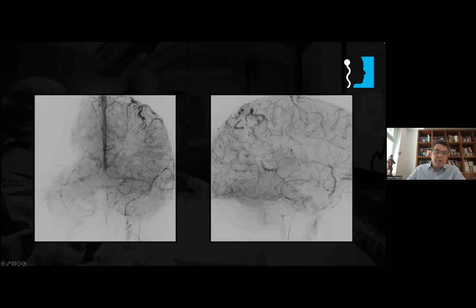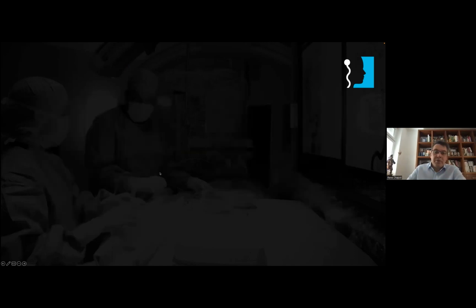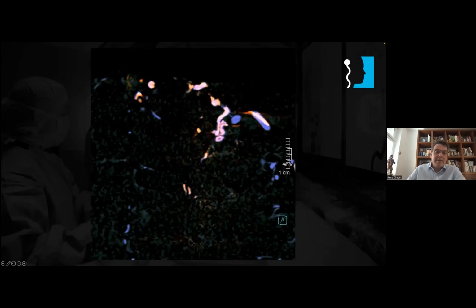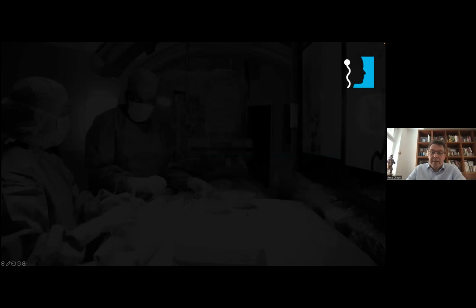But you see that the AVM is not cured, so there was a 3rd step to go to the vein I just showed, which is this one here. Let's look at it again. This is the vein that is remaining, and this vein is the same one that we could see before. This is the remaining vein for step 3, which is the one we could see during step 2. In step 2 it was blue because we did not have a selective injection to this vein, but because of the different colors, we can see a lot of things. And of course, it enabled us to bring the AVM to a cure and to have the AVM completely done.